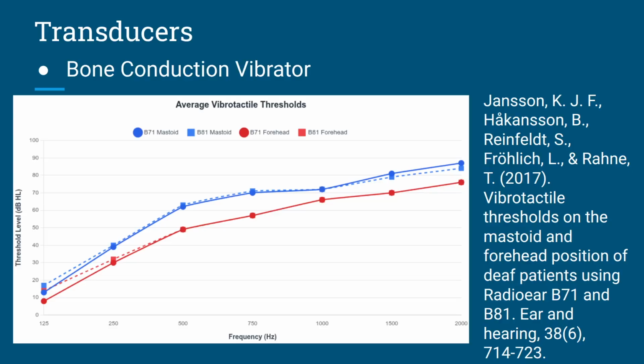Now, bear in mind, if you're calibrated to a mastoid, you can't just switch it over to the forehead. There are different reference calibration standards. So the technician that calibrates your equipment has to be the one that calibrates it accordingly.